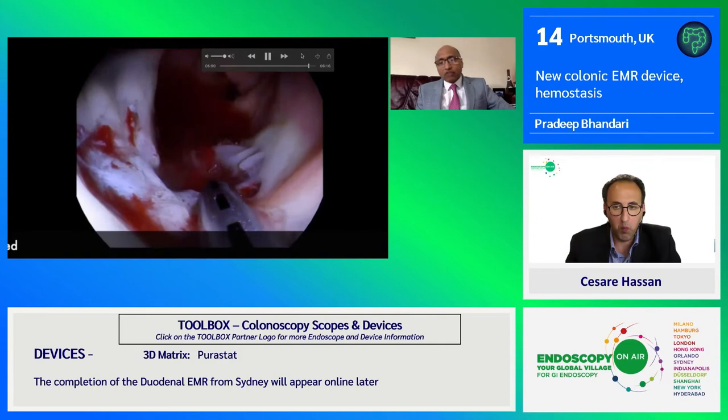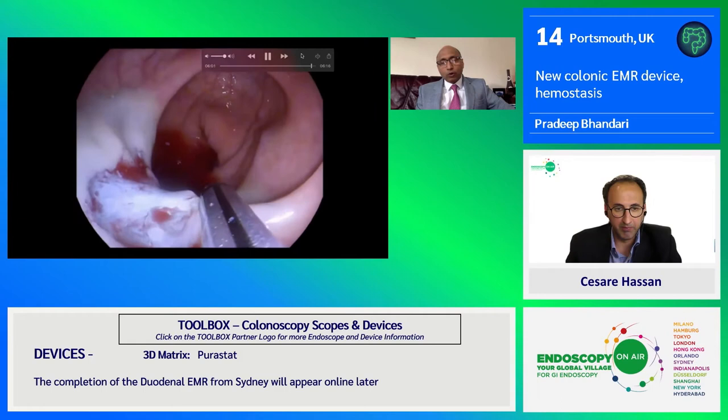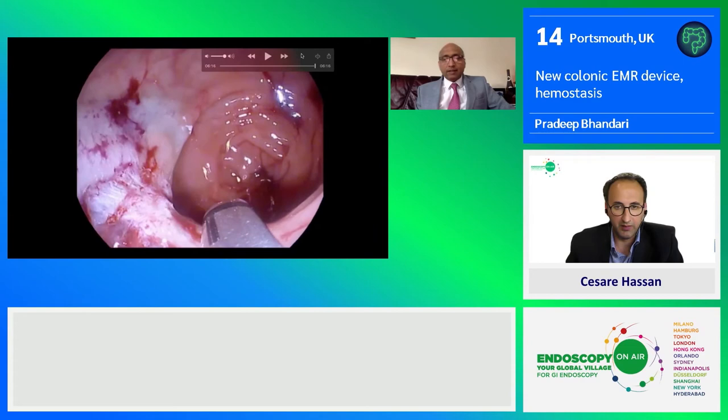You can see we managed to shave the scar a bit more to be very sure that there's no residual lesion left. Because it's got very good suction, you can suck all the blood or fluid easily, just a little bit more shaving backwards and forward. With a little bit of spray of water, you can see there is no residual adenoma left, everything has been resected — job done.